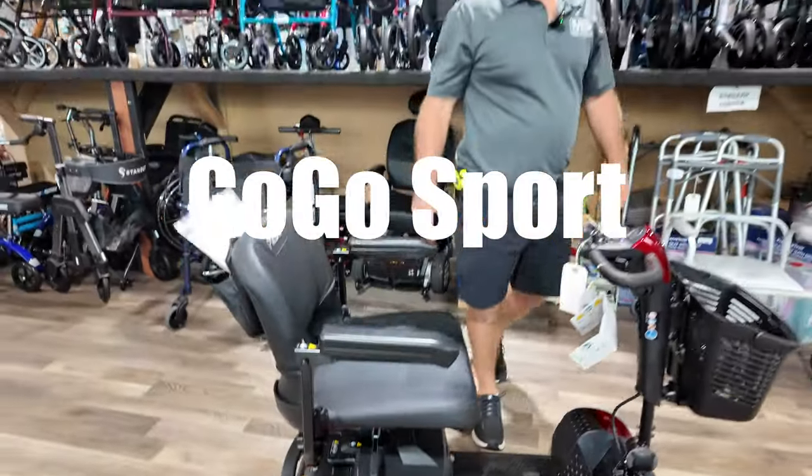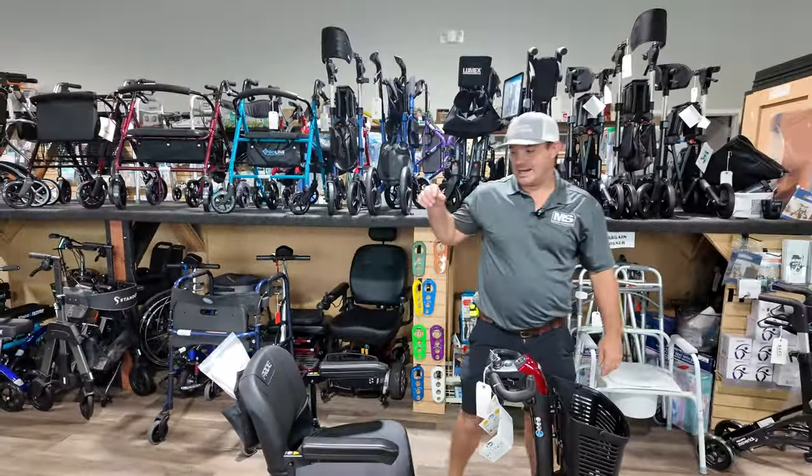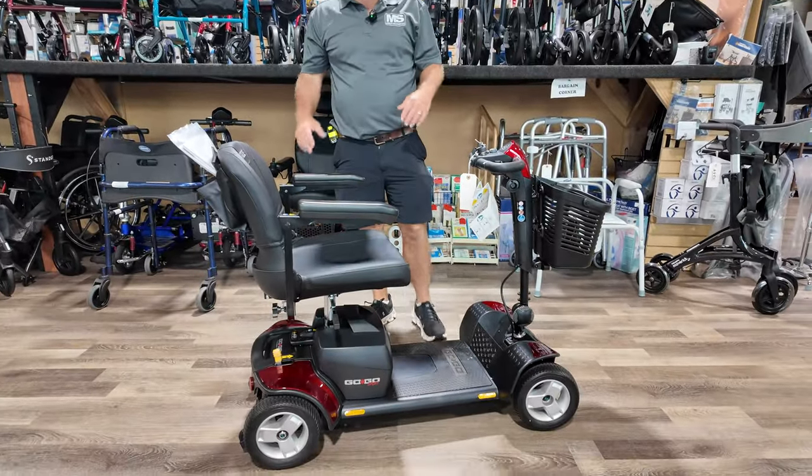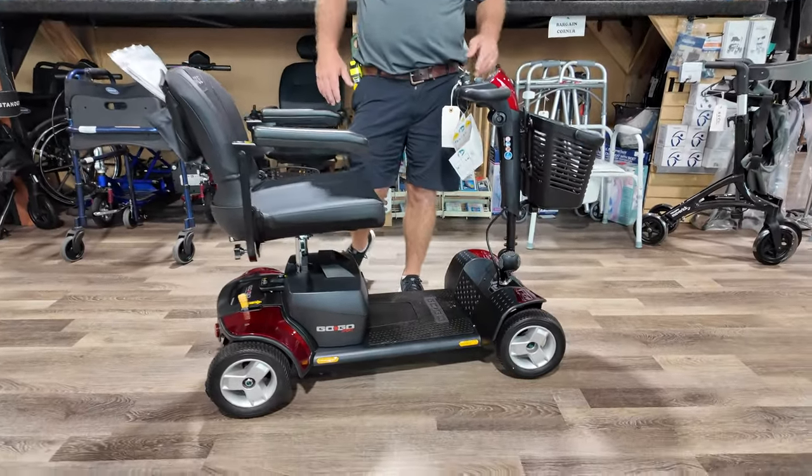Hey, I'm Chris with Mobility Solutions, affordablemedicalusa.com, and I have the GoGo Sport, which is one of the most popular mobility scooters in the GoGo family.